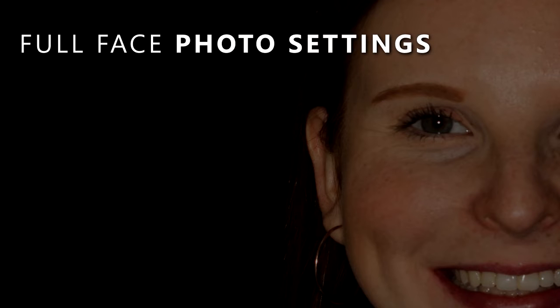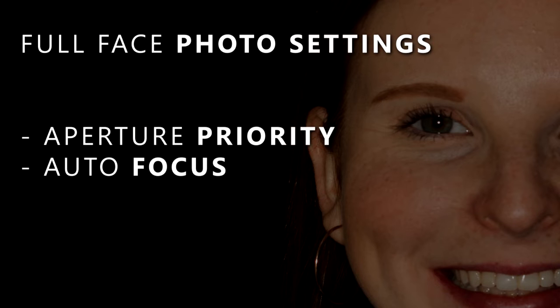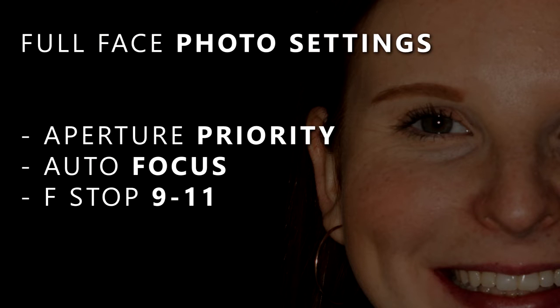I'd like to introduce Becca. She's going to be our model for today and what we're going to do is start out with the full face photos. Having Becca in the assistant chair allows me to be sure that I am parallel to her vertical axis and parallel to her occlusal plane. For full face photos we want to make sure we're set on aperture priority with autofocus on the lens and an f-stop between 9 and 11.